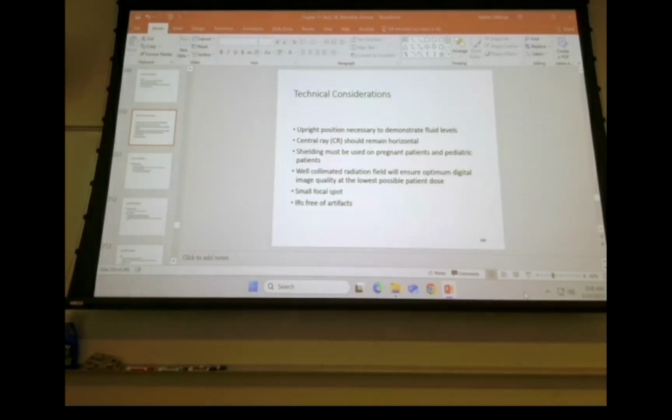You can see where the air is. You can see where the fluid is. Can you see a clear mark? No. But can you see that there's fluid there? Absolutely. That's with a 45-degree angulation. So do you think it's going to be that dramatic with 15 degrees? The answer is no, it's not.